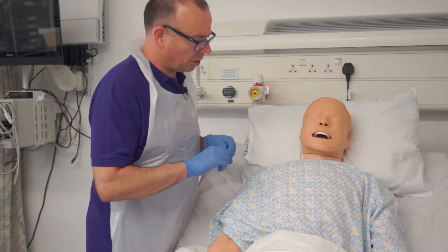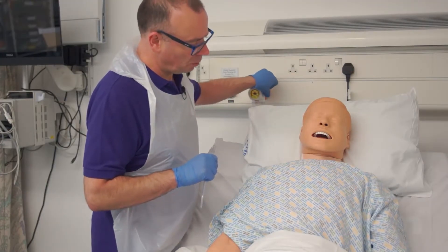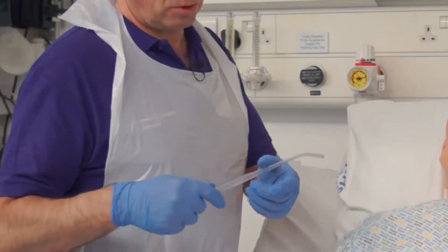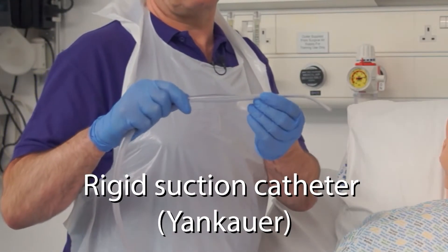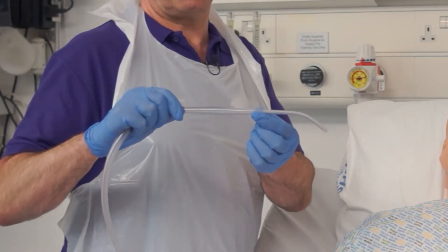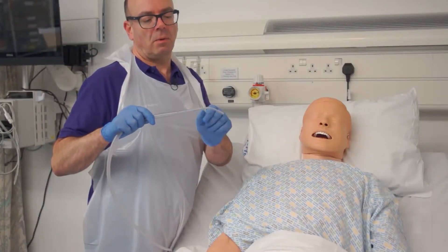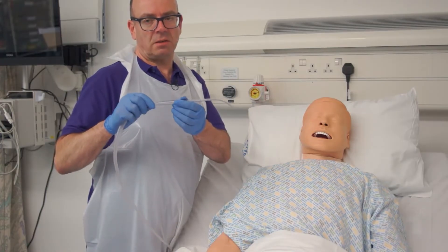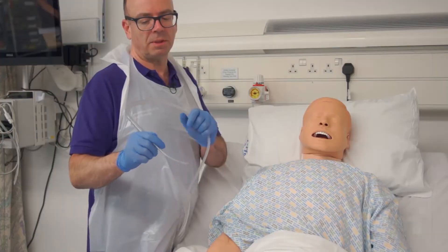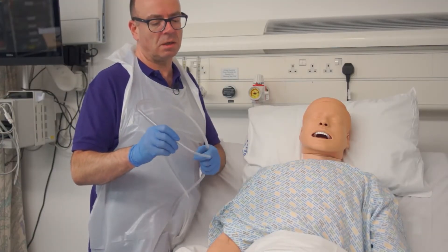Bob, we're going to help clear some of those secretions from your mouth using a different kind of suction catheter. Our other option is a rigid suction catheter, useful for moving a lot of highly viscous material from a patient's airway. However, the rigidity of the catheter means there's a higher risk of doing harm, so we'll exercise caution by keeping the tip of the catheter where we can see it at all times.